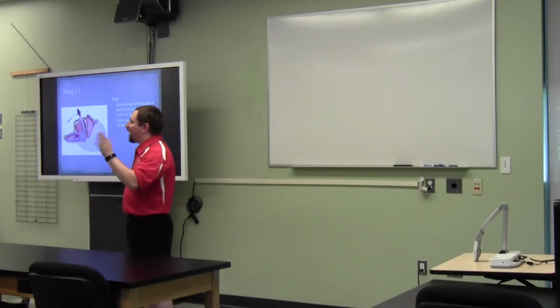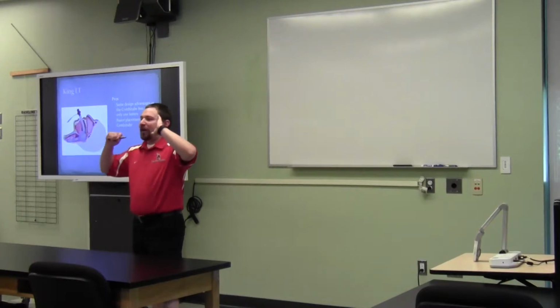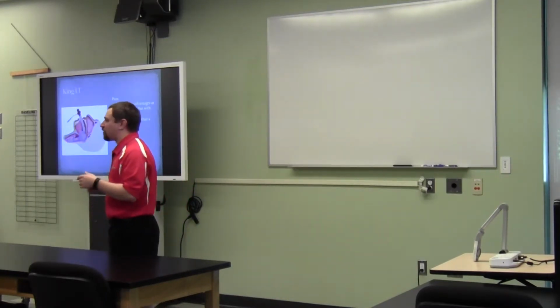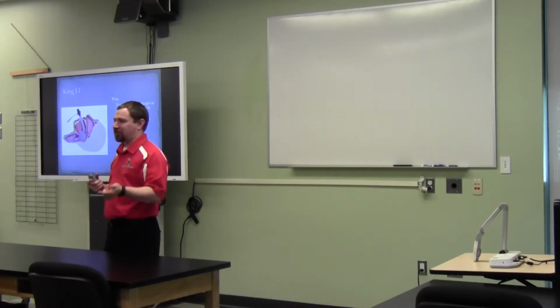It's the fact that pretty much 98% of my students are able to do this in 30 seconds or less, blindfolded, because you don't actually have to be able to see what you're doing. Think about it, you've been doing CPR, you're sweaty, it's raining. You can place this airway in the middle of the field under stress by pure muscle memory if you get enough practice and repetition with this.